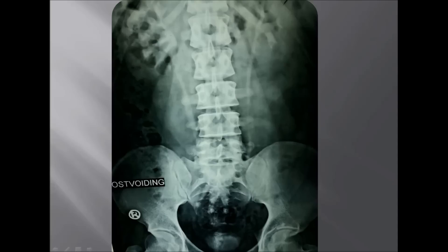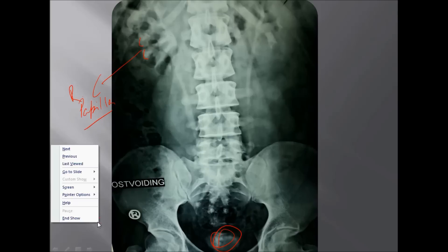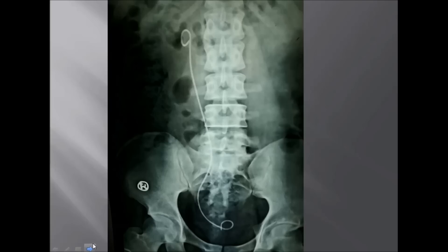This is the post-voiding film. Now we can see very clearly the cupping of the renal papilla — it is a very classic appearance. Here we can also see the dye accumulated in the urine after voiding, so we can see a lesser amount of urine compared to the pre-voiding film shown earlier.